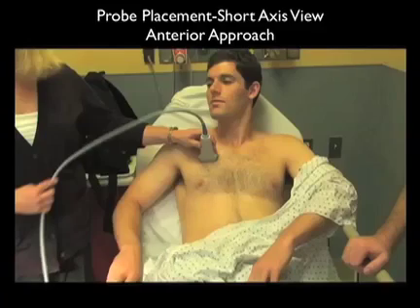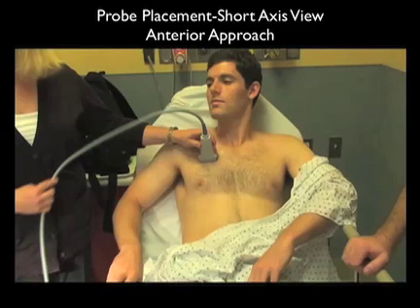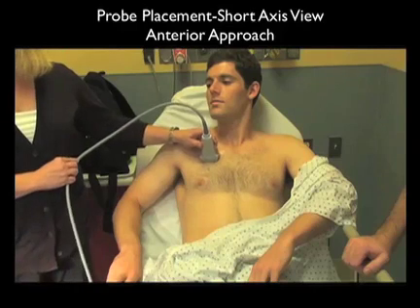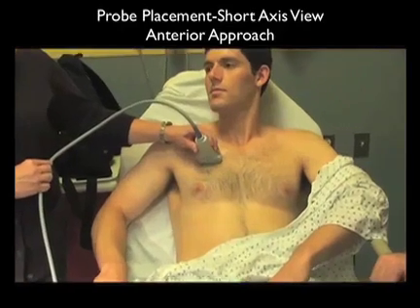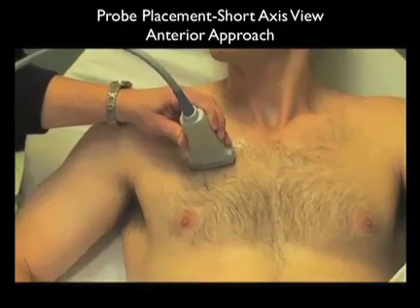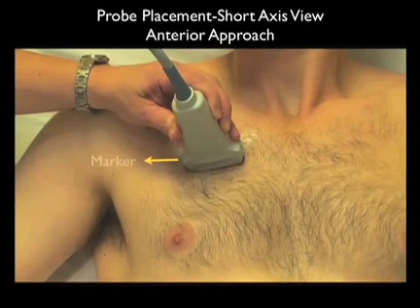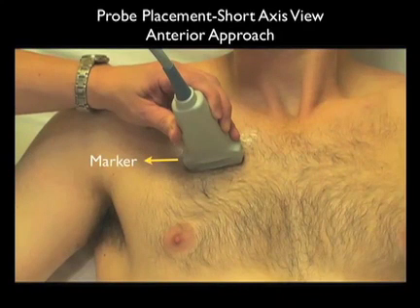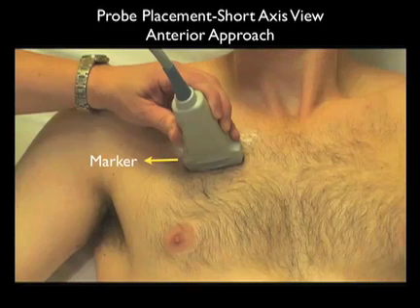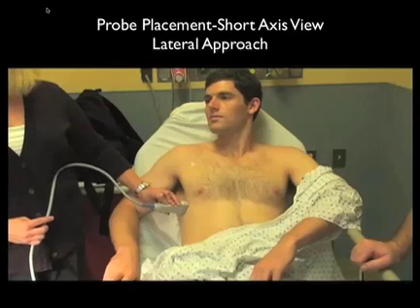Once we've identified both the ribs and the pleura, we can swivel the probe into the short axis configuration to further look at the pleura and to detect pneumothorax. Here we have the probe oriented in a transverse or short axis orientation between the ribs, looking directly down at the pleura. Notice in this case the marker dot is located towards the lateral aspect of the patient. Using both long and short axis configurations will allow you to detect a pneumothorax with a high degree of accuracy.